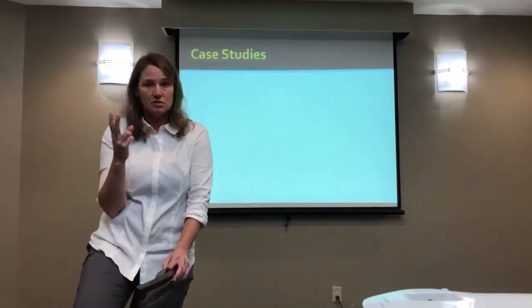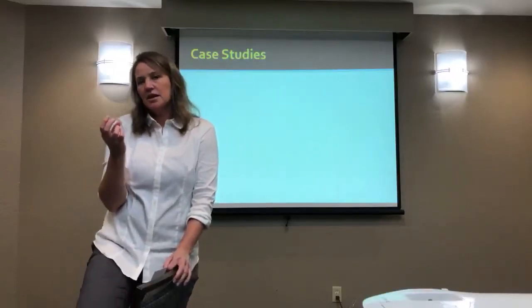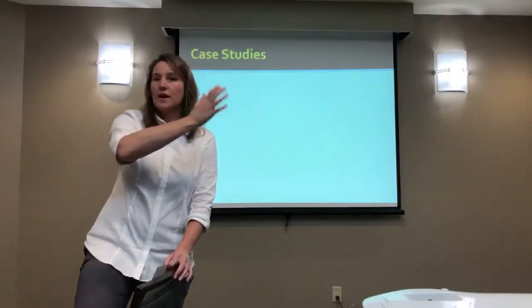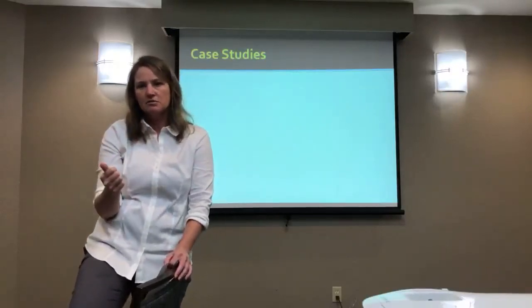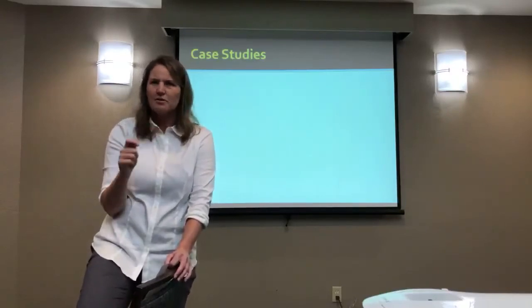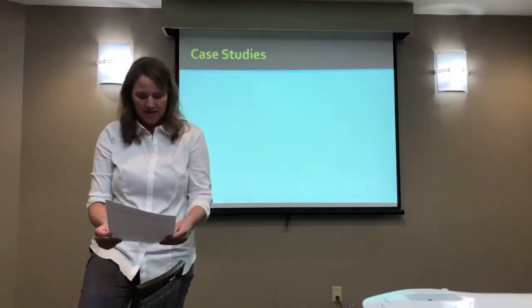Right. But what we're going to do is use 1 megahertz to get to that target. We're using continuous, agreed? What about intensity? So again, it's back to the size and the depth and how big this person is, and your technique as well. So 1 watt per centimeter squared, all the way up to 1.5 or 2 watts per centimeter squared. The combination of the size of the muscle and the depth of the area, combined with your technique, is going to make a big difference. This is something I want to practice in the lab, feeling the amount of heat that you get based on the size of the location, combined with these other factors, the parameters.